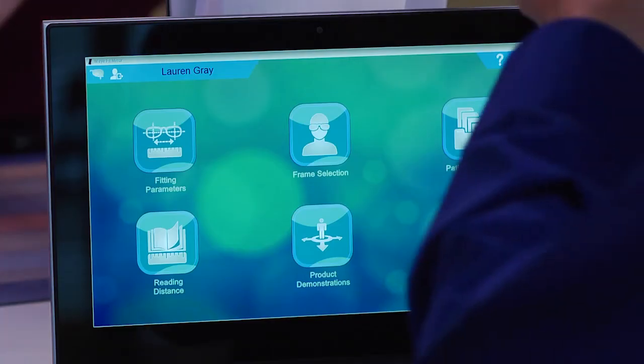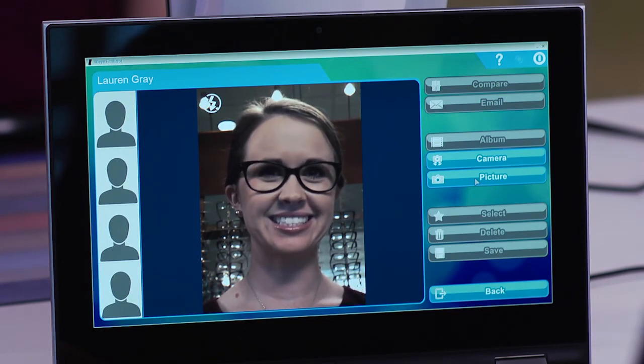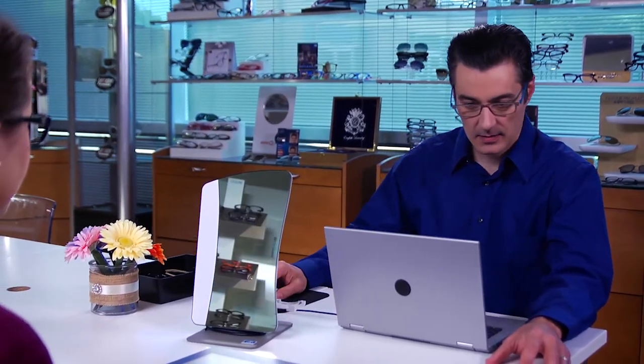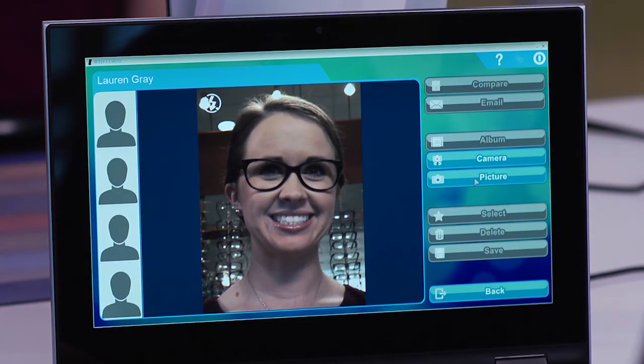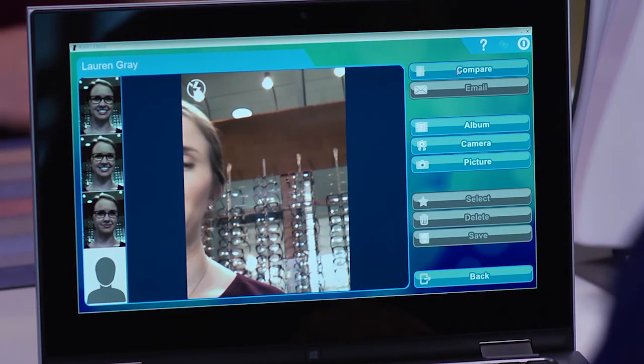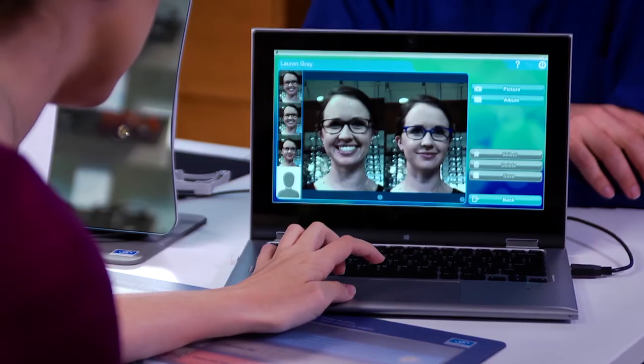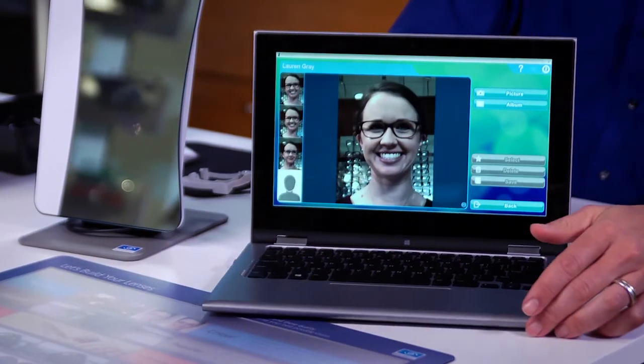If you're having trouble telling how you look in the frames without your prescription lenses, we can use MyFit Mirror to take pictures of you. To use the frame comparison tool on your MyFit Mirror system, click on the frame selection icon on the home page. Have the patient sit down with the frame she's selected right in front of the camera and position the equipment so the patient appears on the screen. You can take fixed images by selecting the picture icon. To use the flash, click on the flash icon. You can take up to four pictures. Compare the pictures by selecting the frame selection icon. Click on an image to remove it from your selection or select it on the sidebar to add it to your selection. Click on the album icon to adjust the white balance on the images as needed.